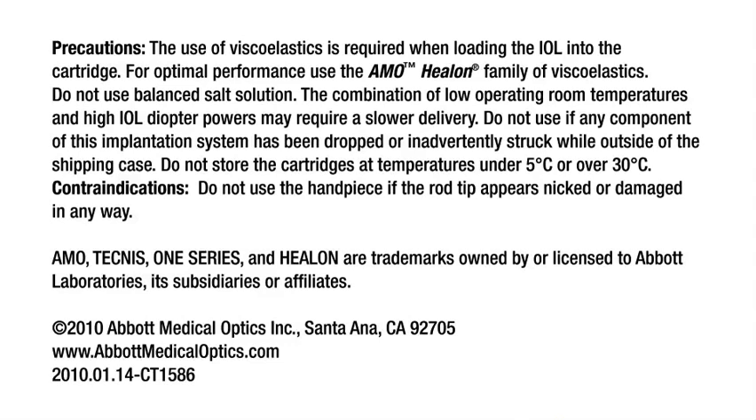Do not use balanced salt solution. The combination of low operating room temperatures and high IOL diopter powers may require a slower delivery. Do not use if any component of this implantation system has been dropped or inadvertently struck while outside of the shipping case. Do not store the cartridges at temperatures under 5 degrees Celsius or over 30 degrees Celsius. Do not use the handpiece if the rod tip appears nicked or damaged in any way.